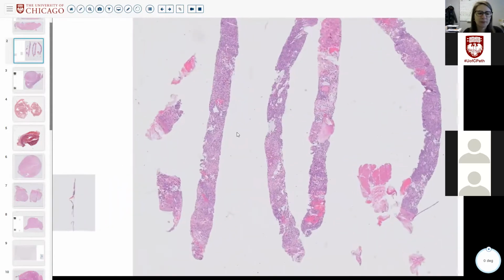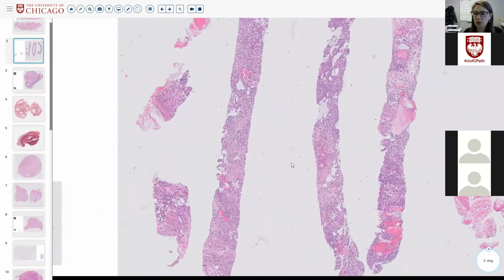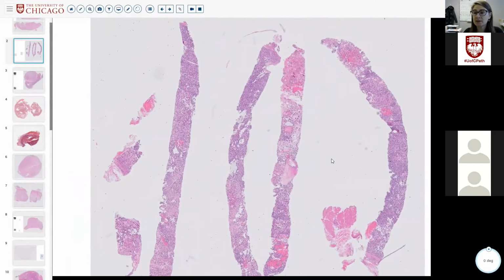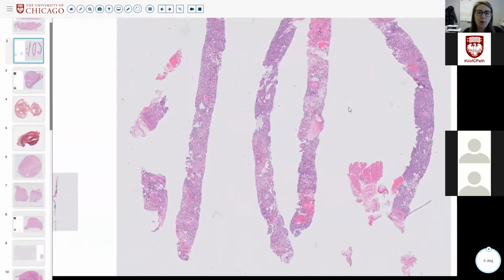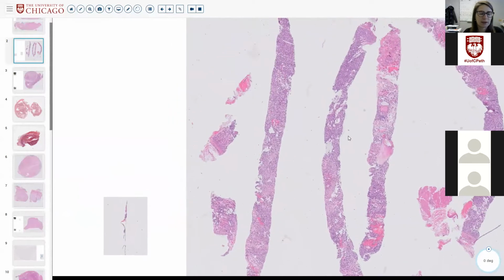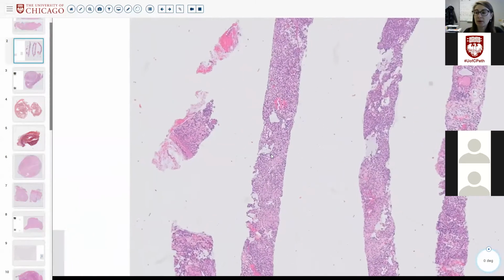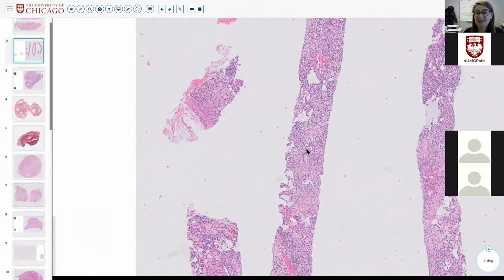All right, so last time we talked about thyroid core biopsy, and some of you asked why it's challenging or how often we get it. So here's a very recent example of a core biopsy we got from our famous hospital in Valparaiso, Indiana, that does these. I wanted to show you an example of the core and then what the follow-up was on histology. Does anybody want to take a gander at describing what they see on this core and what their differential diagnosis might be, or what they want to communicate to the clinicians, based on our knowledge of thyroid FNA as the model of thyroid biopsy?